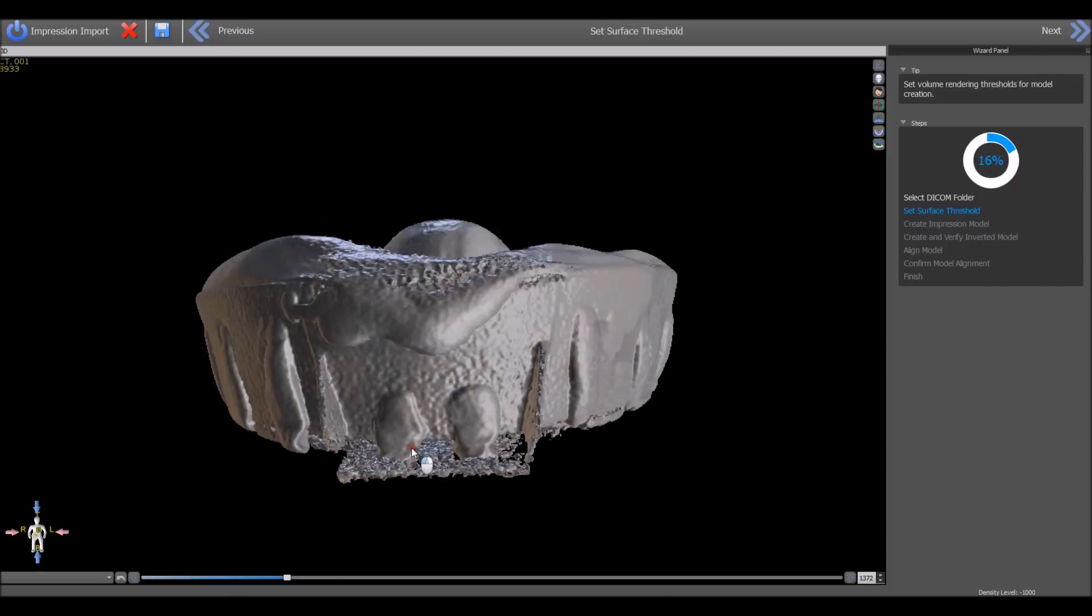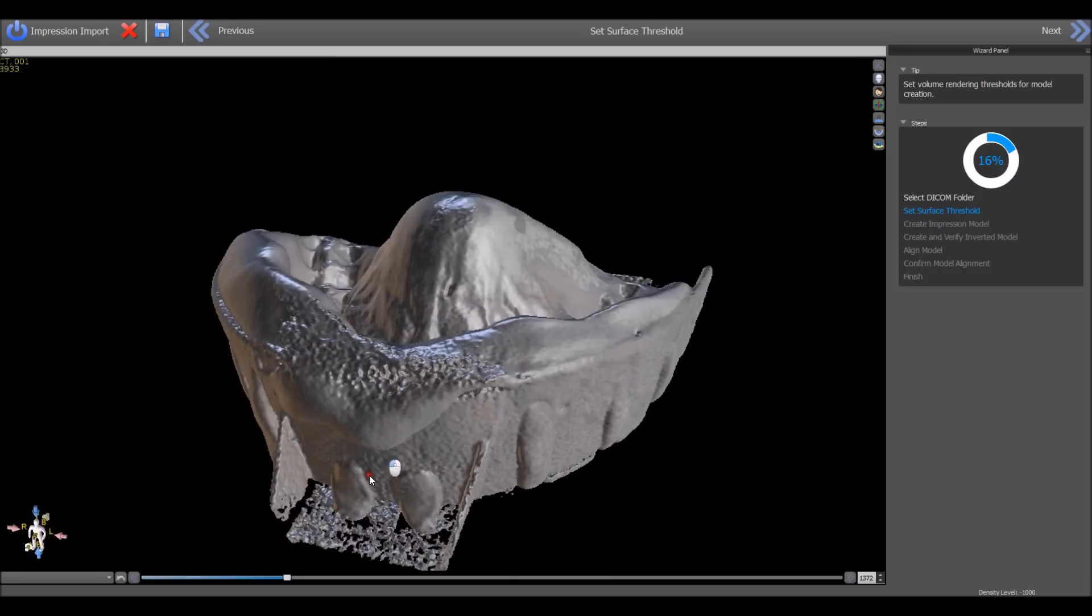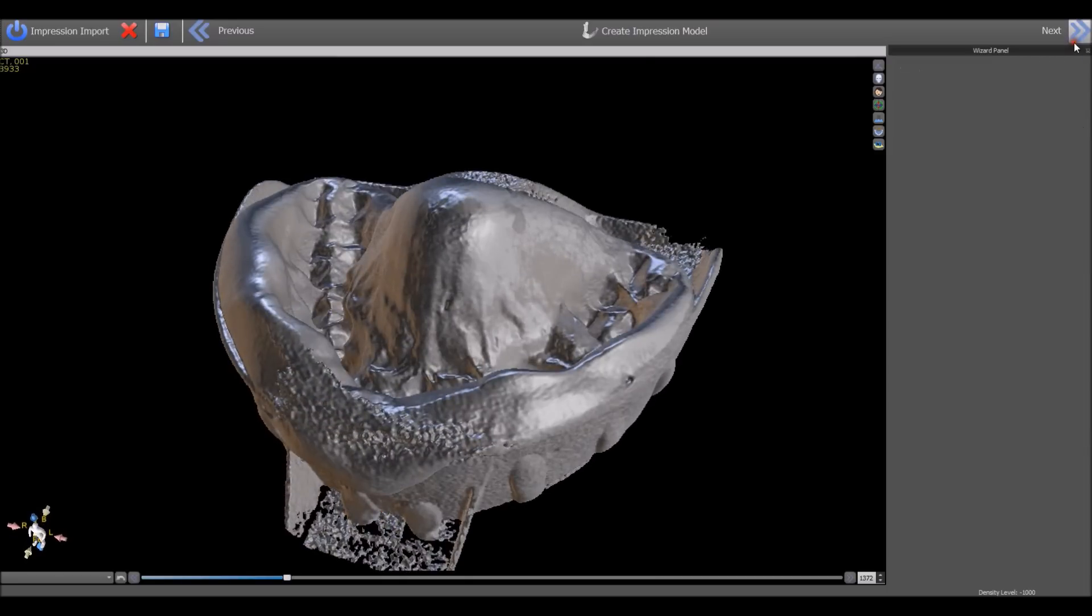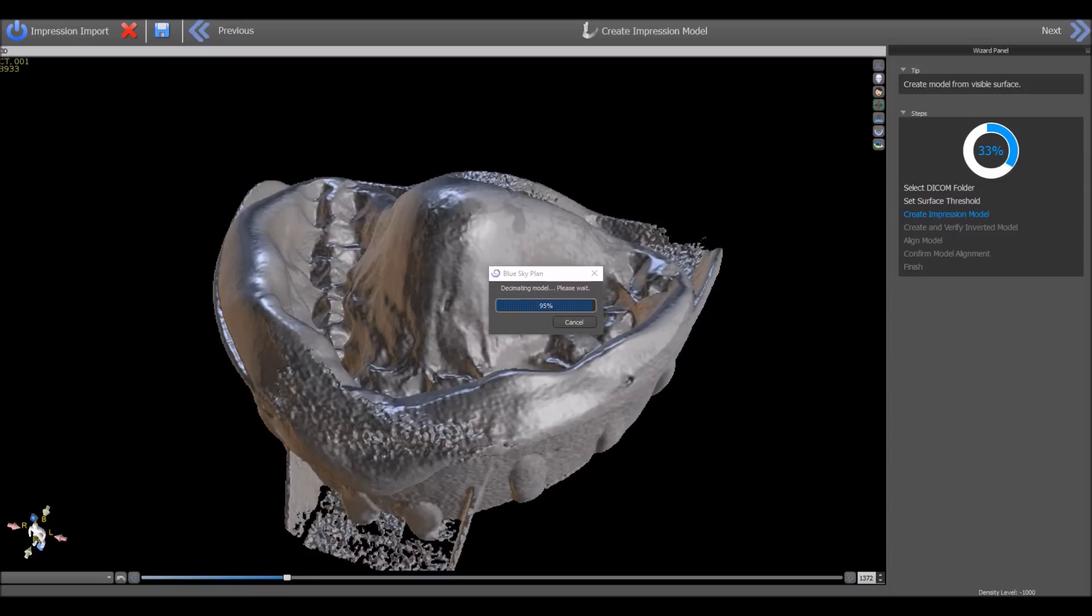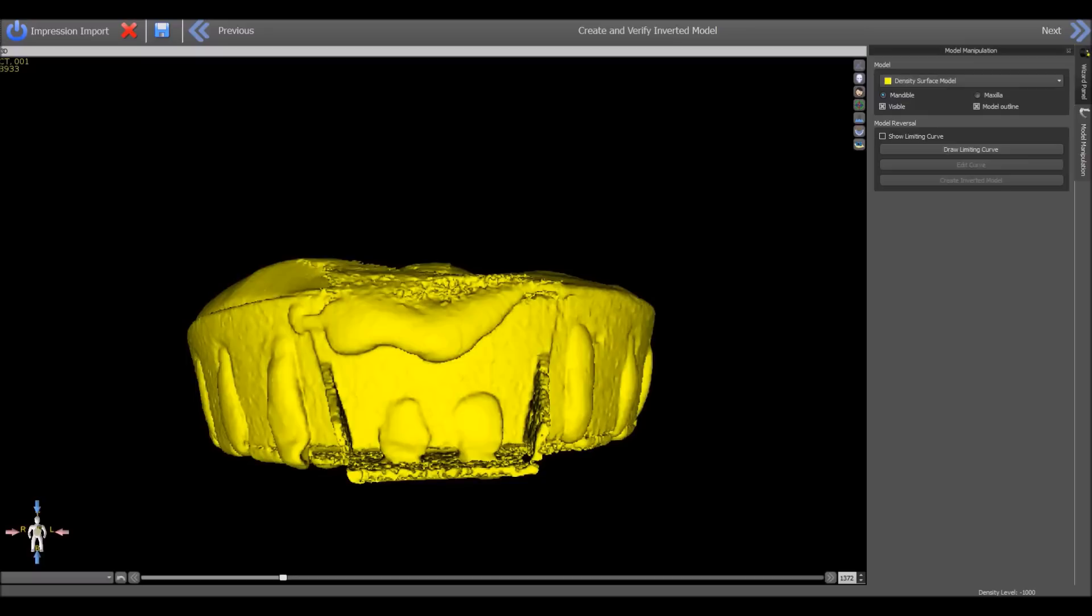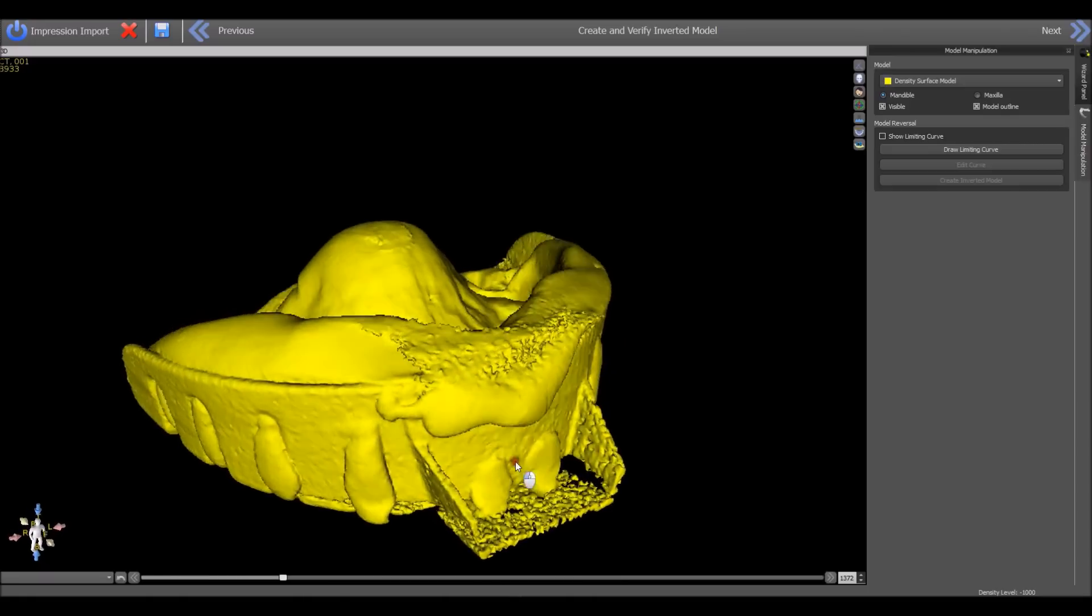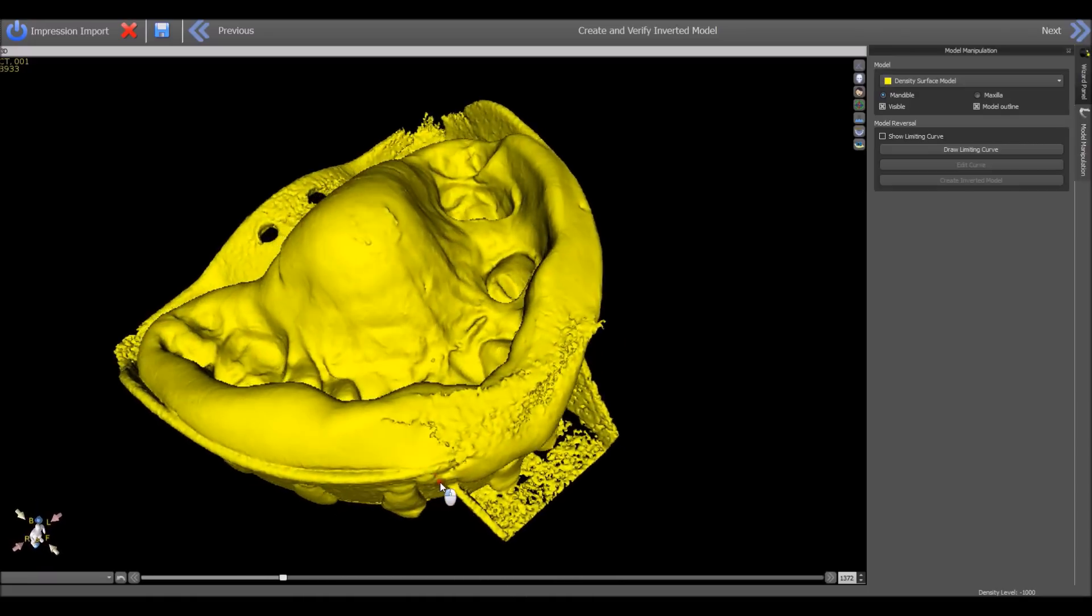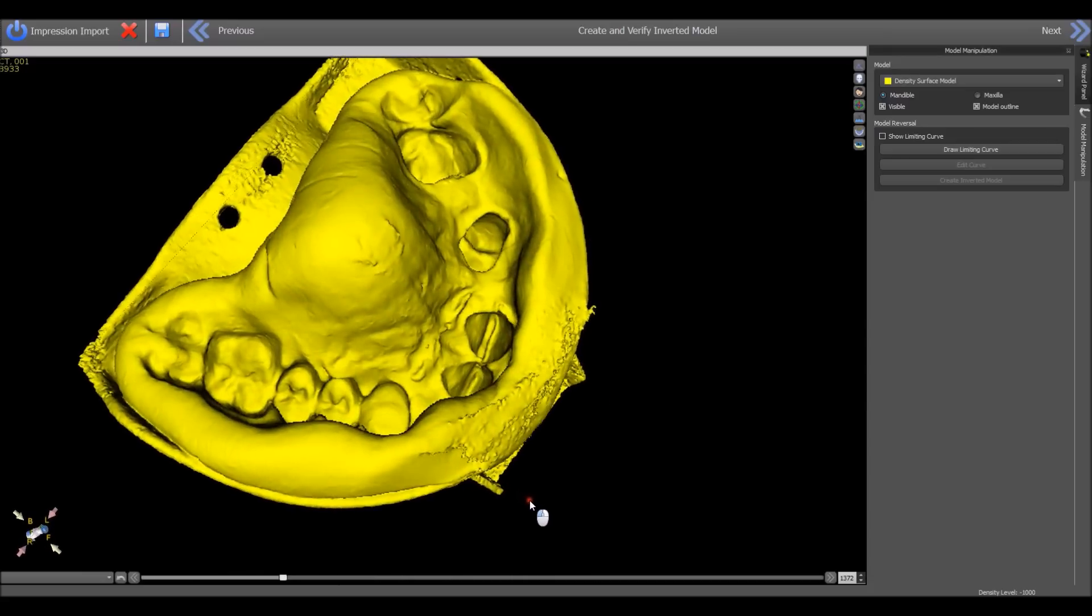Once we have done that, we can press next and the software will convert the DICOM files into an STL surface. Now the software has converted an impression from DICOMS into an STL surface, and we're going to draw a curve to define the relevant area that should be inverted.